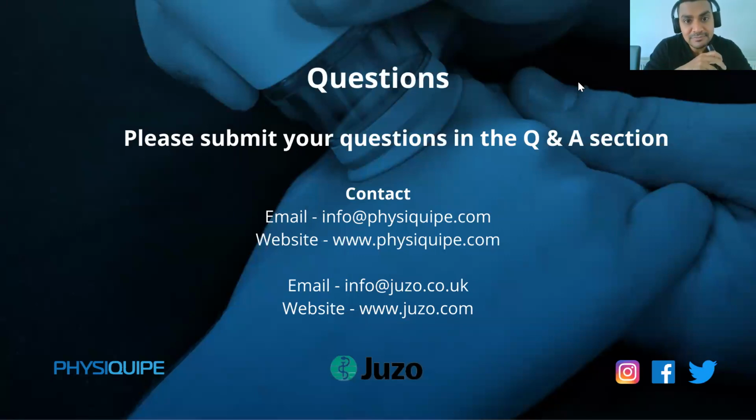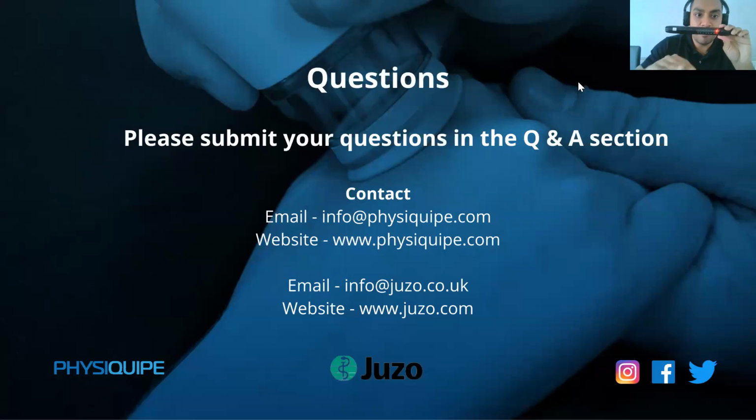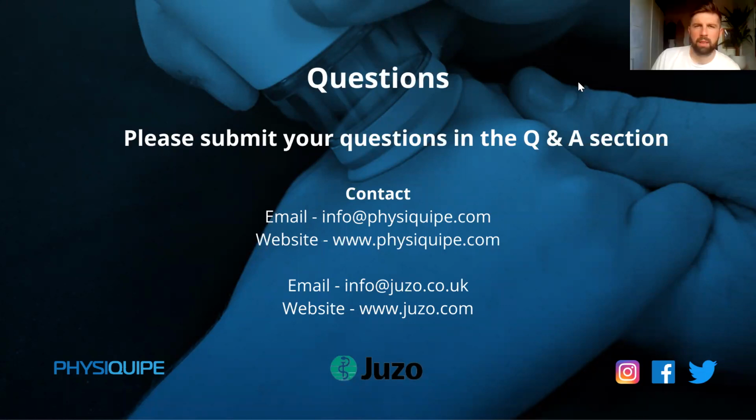I mean, there's low level light therapy, and that's different to laser. This emits a class 3B laser. Obviously, it has a classification and needs a clinician to use it. We can't sell this to the public, whereas an infrared light you'd find in a DVD player. As it's classified as a 3B, it's a lot more powerful than what you'd find in an infrared light, effectively.